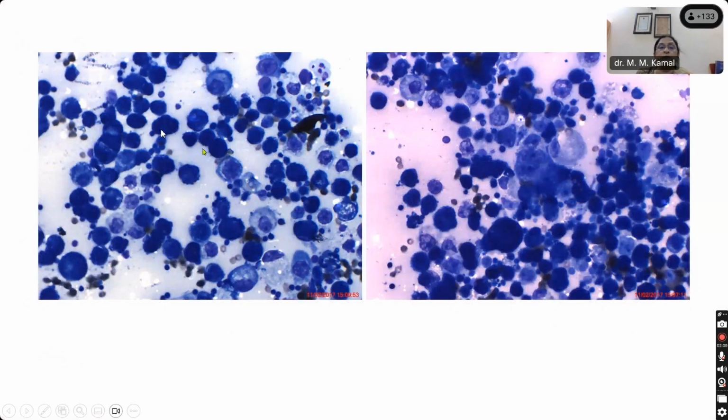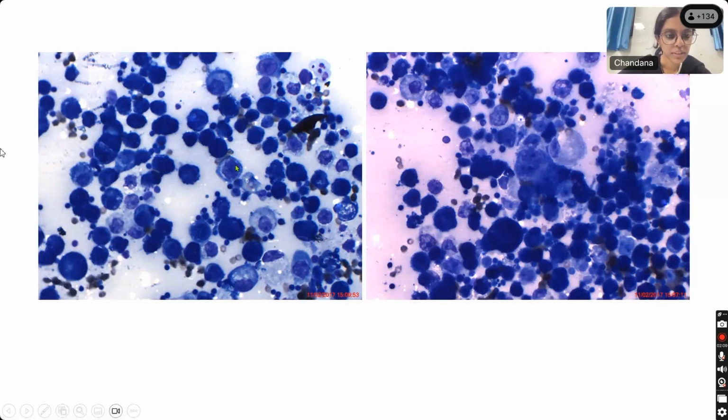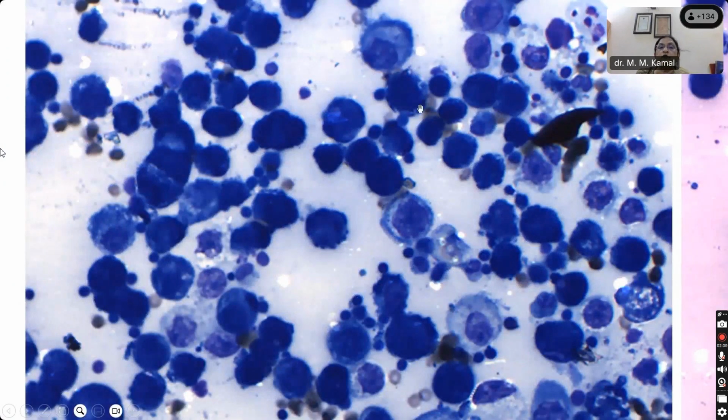Now, this smear, what would you describe it as? Smear is highly cellular with tumor cells scattered in the smear, with cells polygonal with central to eccentrically placed nucleus showing prominent nucleoli with moderate amount of cytoplasm. Now, what is telling you that it still belongs to the mesothelial family? The two-tone cytoplasm? Yes, ma'am. Two-tone cytoplasm with windows. See the windows between margins of the cytoplasm? Yes, ma'am. Central large nucleus, but then they are highly atypical and there are too many of them.